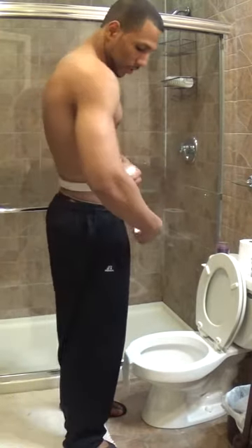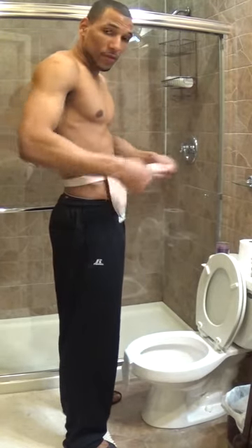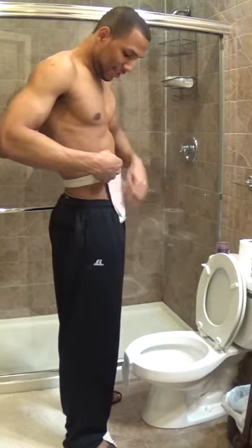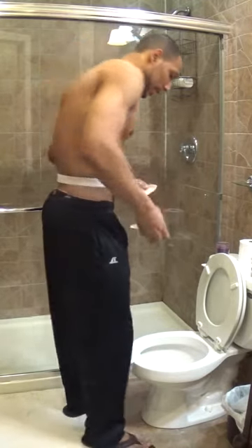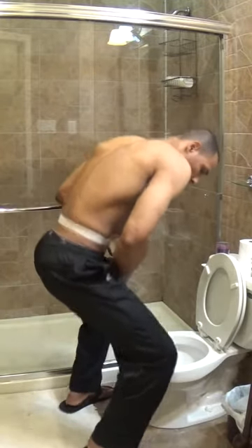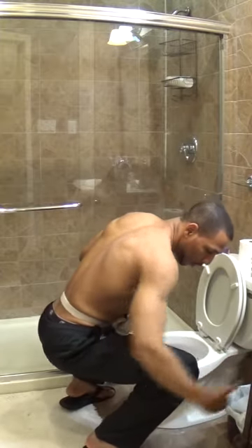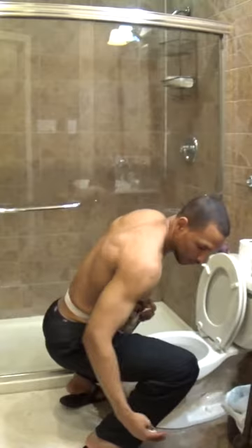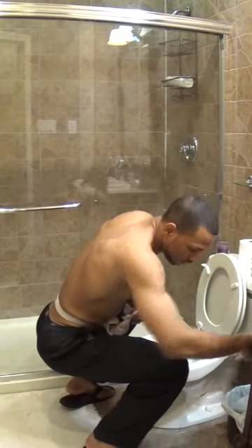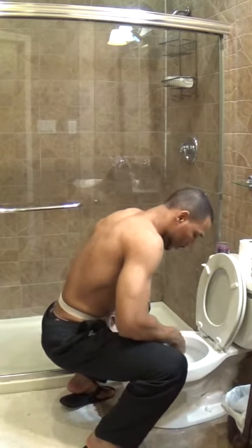Now you're going to empty your ostomy bag — just work all that food down, all that out of the bag. You're going to squat down. As you see, I'm squatting, not kneeling, and no part of me is touching the toilet. If you're in a public restroom, it's not going to touch the walls, you're not going to touch the toilet. You keep your clothes clean. The reason you put the toilet paper in is so it doesn't splash up — it absorbs it.